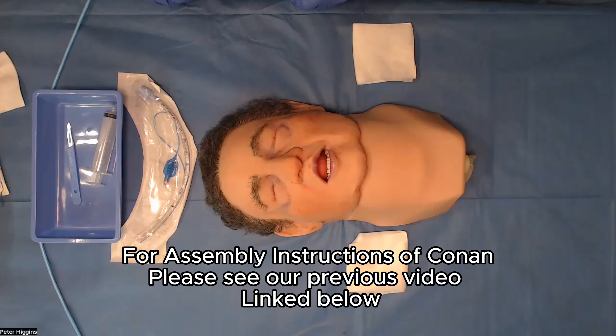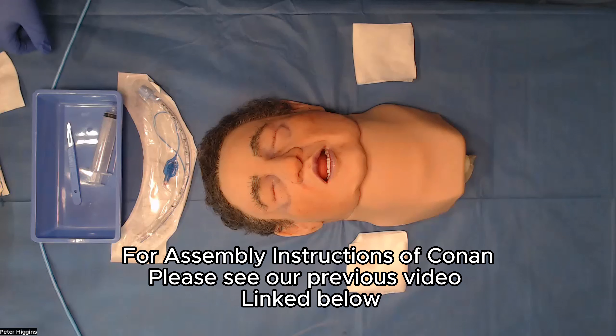Hi team, Pete here for Embedded Effects. I'm here today to demonstrate Conan in his full working capacity. I'm going to go through making a skin incision, the blunt dissection down through to the trachea, incision in the trachea, and then inserting the endotracheal tube through that small incision. For setup instructions of Conan, please see our previous video.